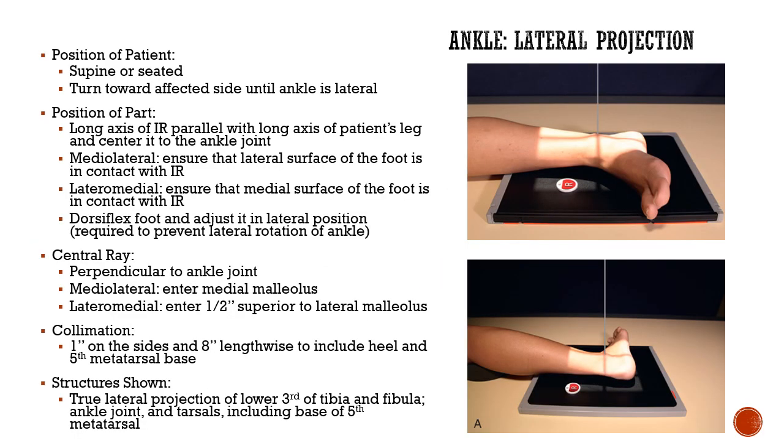For the lateral projection, we're going to have the patient turn toward the affected side, which is very similar to the lateral calcaneus. We can do a medial lateral or lateral medial. It's more common to do a medial lateral though. So for the medial lateral, we're going to make sure that the lateral aspect of the foot is in contact with the image receptor, where the opposite is true for the lateral medial.